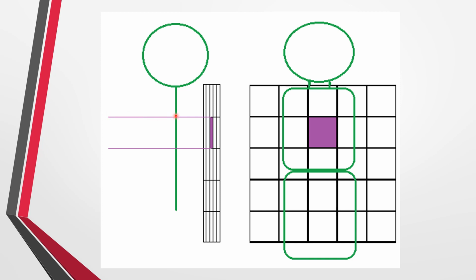So this information that's being gathered from the anatomy is going to land on these cells. For our purposes, these cells are the detector cells, or the DELs. In our location system, this cell here would be A, B, C, 1, 2. So this would be C2, this cell right here. And the information from this example would be purple.